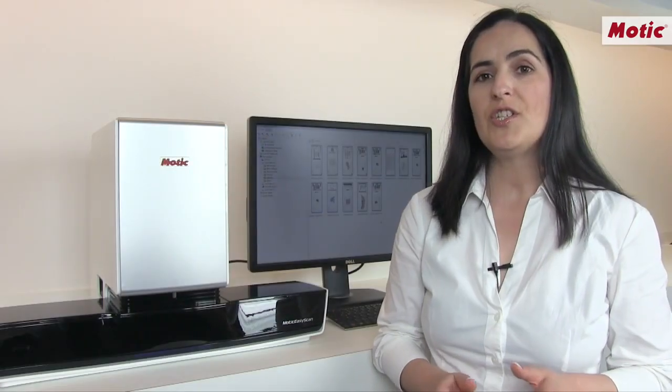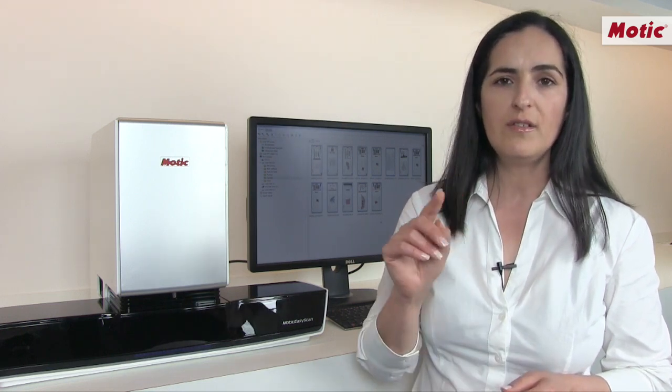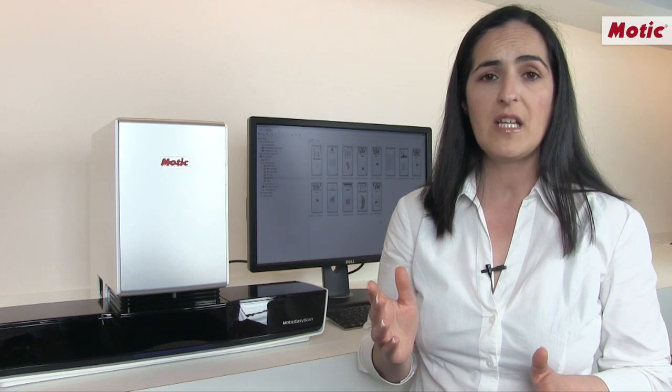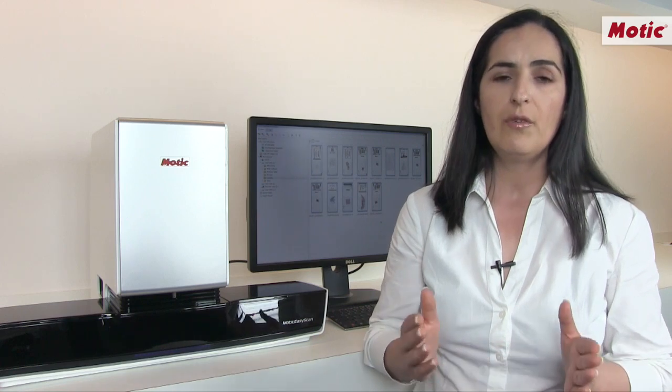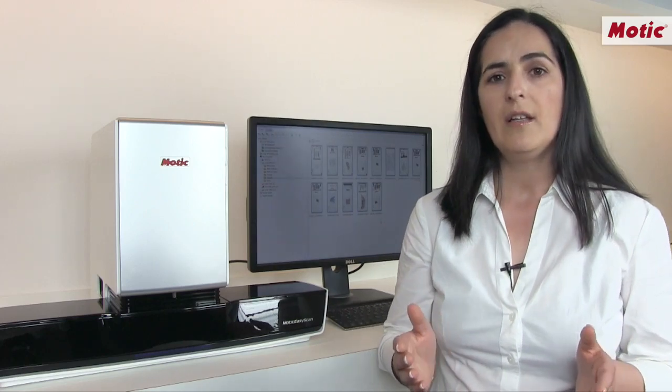The scanning process originates images which are available in a digital format through the DS Assistant software. The software includes a slide database where all the information is stored in a library, where each file is presented in the .ds format, which means digital slide format. The DS format is in fact an interactive information package which saves the information from the sample and links it with a barcode, with a slide map, as well as with any kind of attached documents. For instance, you can add a PDF document, a JPEG image, any kind of report in Word format, Excel format, etc.